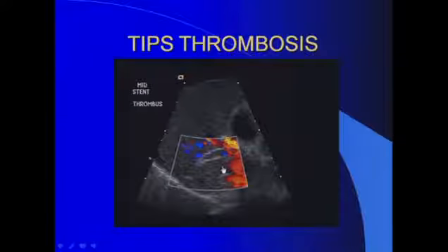It's also worthwhile evaluating the stent with power Doppler, because power Doppler is more sensitive to sluggish flow, and if you see the same thing by both, most likely this TIPS is thrombosed. Additionally, some vendors have something called B-flow imaging that can also be sensitive for evaluating these TIPS and can improve the confidence of making the right diagnosis about thrombosis.